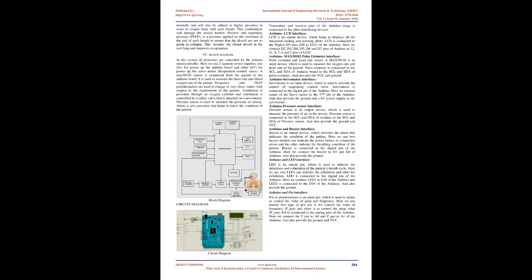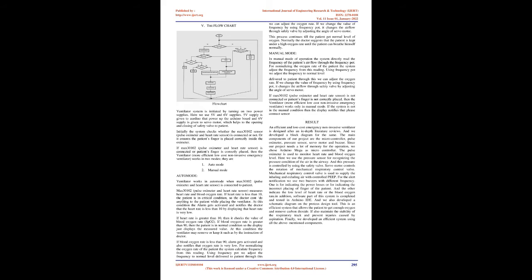Inspiratory, expiratory ratio. Inspiratory, expiratory ratio refers to the ratio of inspiratory time to expiratory time. In normal spontaneous breathing, the expiratory time is about twice as long as the inspiratory time. This gives an IE ratio of 1:2 and is read 1:2. The total time of a respiratory cycle is determined by dividing 60 seconds by the respiratory rate. Inspiratory time and expiratory time are then determined by portioning the respiratory cycle based on the set ratio.